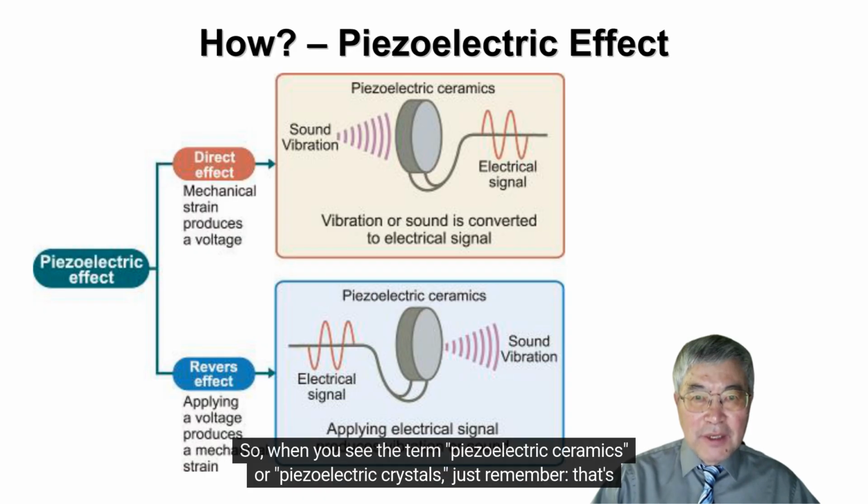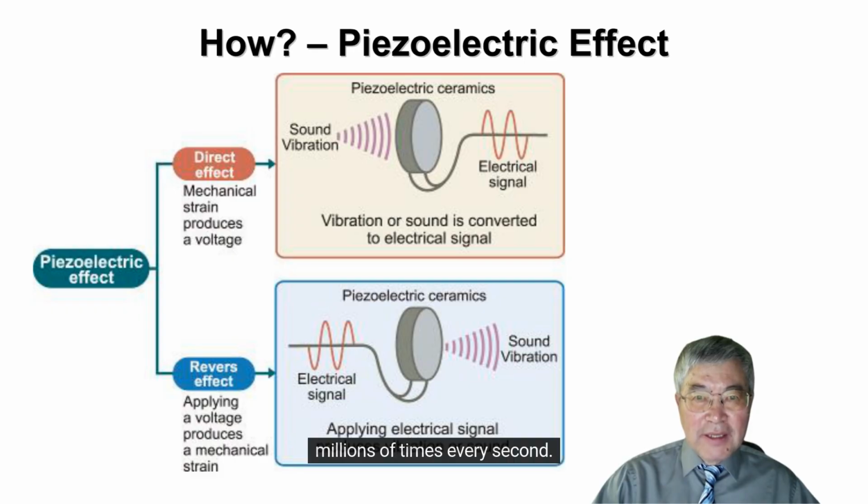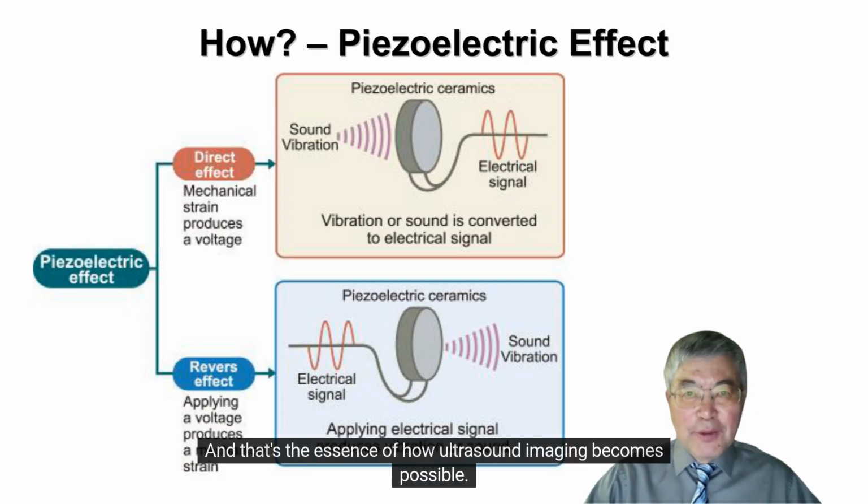So, when you see the term piezoelectric ceramics or piezoelectric crystals, just remember, that's what's inside every ultrasound probe, converting electrical energy to sound and sound back to electrical energy, millions of times every second. And that's the essence of how ultrasound imaging becomes possible.